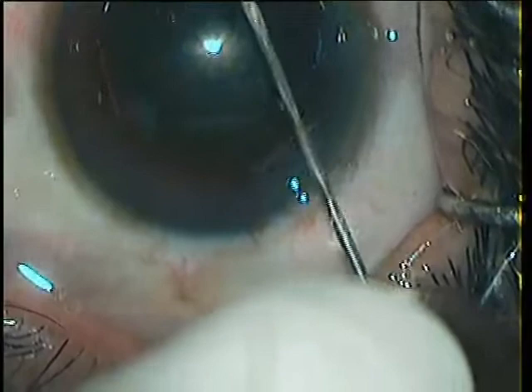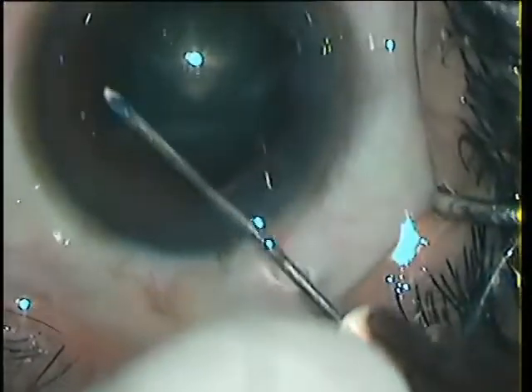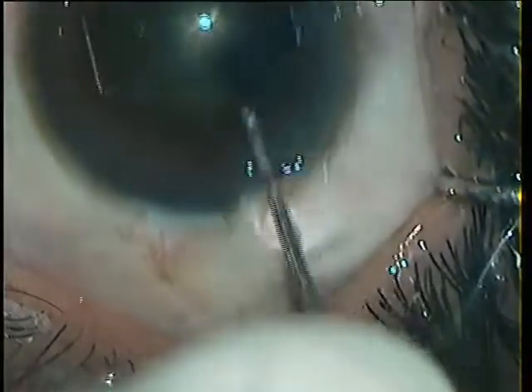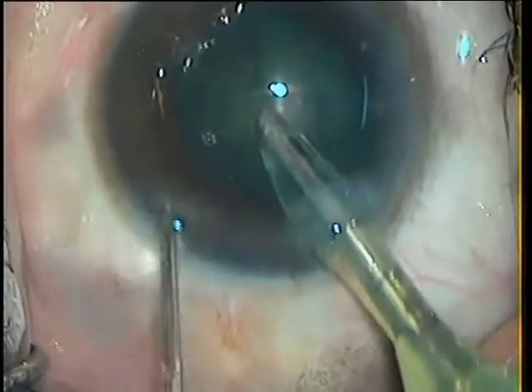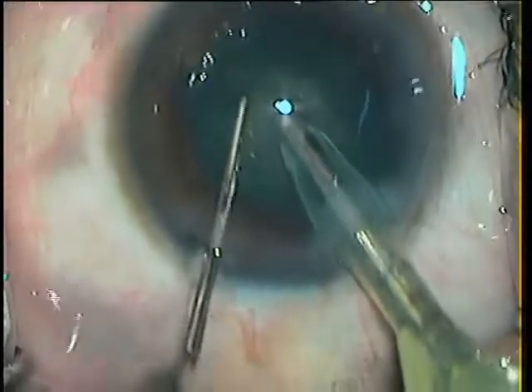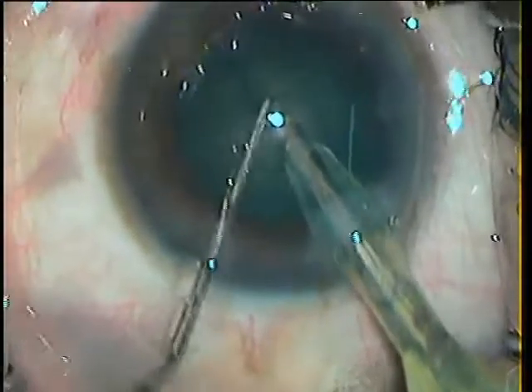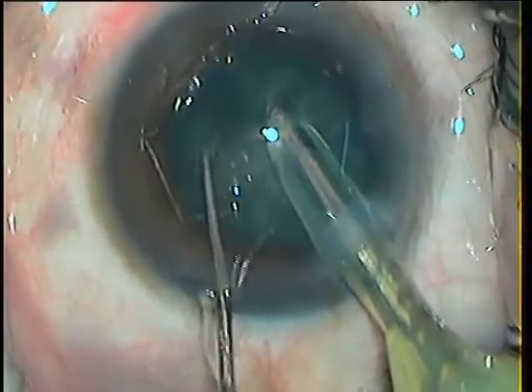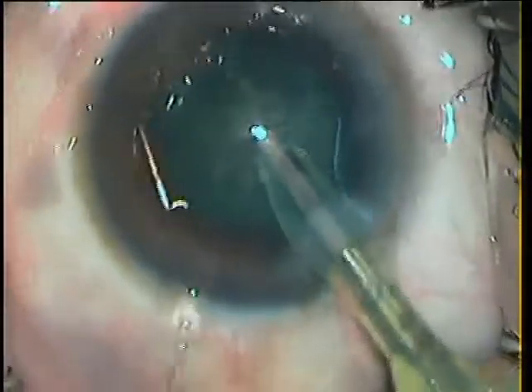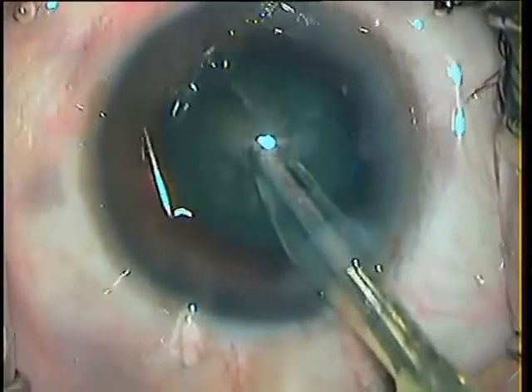And I start with the rhexis. The rest of the surgery is nothing great. I create a small flap, although I will be doing vertical chopping, and then rotate the nucleus 90 degrees. I am having a sharp chopper in my hand. The first crack, the second, the third. And now I have four pieces. I change my chopper to a blunt chopper for emulsification.